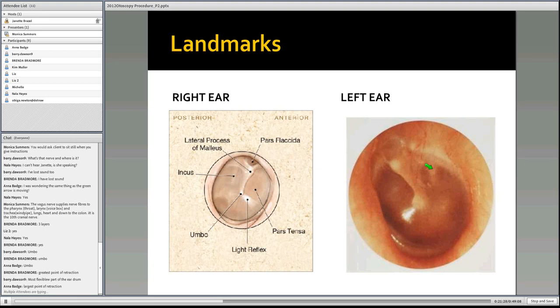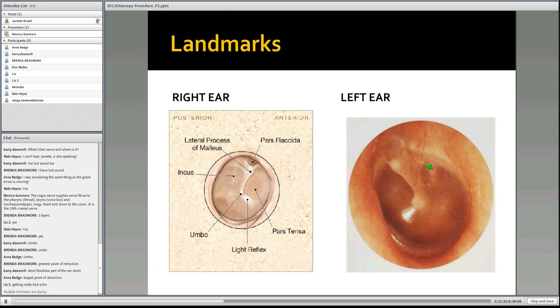You will never see a stapes when you look down someone's ear, a healthy eardrum. It is highly unlikely you will see a stapes, so please don't ever state that you do. The only time I ever saw one was when I was a student, and I looked down someone's ear. They had no eardrum, they'd been involved in a blast, and all the ossicles were just hanging loose and weren't connected, because the traumatic explosion that they were exposed to blew out the eardrum. The ossicles were just hanging down, so it was quite an unusual thing to see.